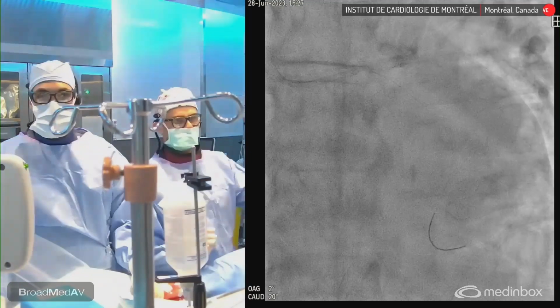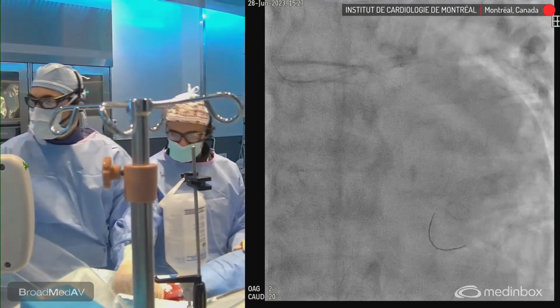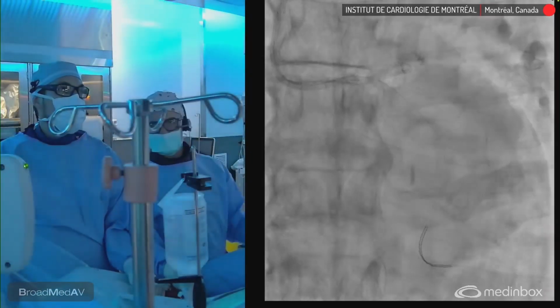So our plan now is to exchange. So I'll just do a cine to make sure there's no complication.